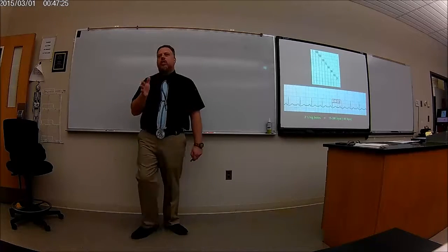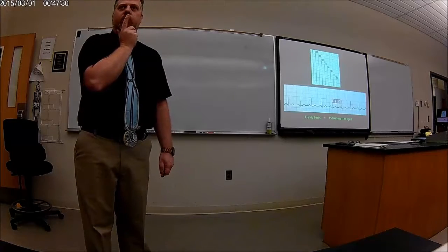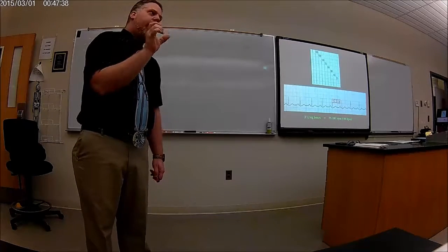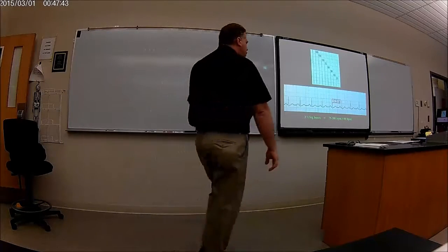If I'm going to give you something, I'm going to give you something that's going to be easier to count. It'll be a regular rhythm. All right? Does that make sense how to do this? That's pretty easy. You're just counting. But it's the big boxes. You'll get the wrong answer if you're counting the small boxes. Okay?